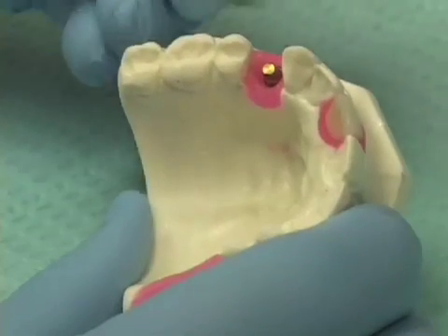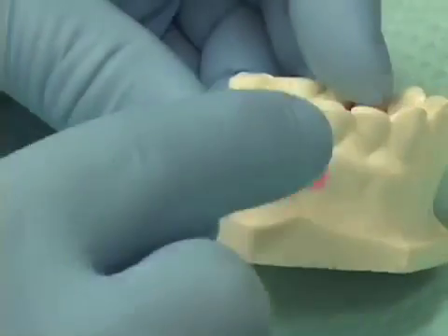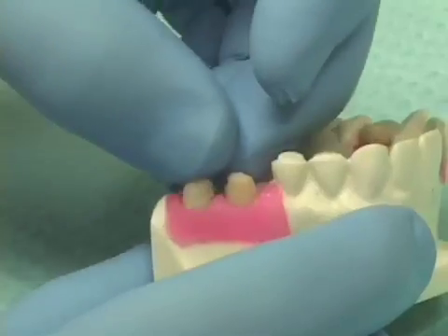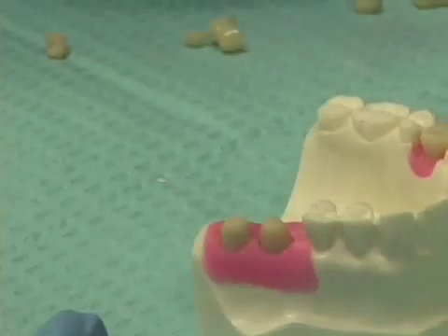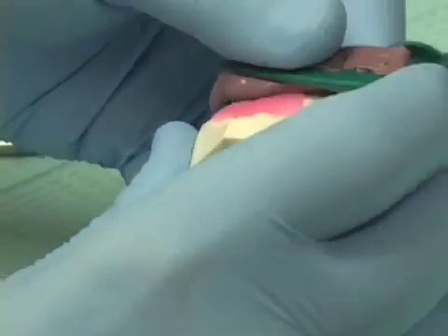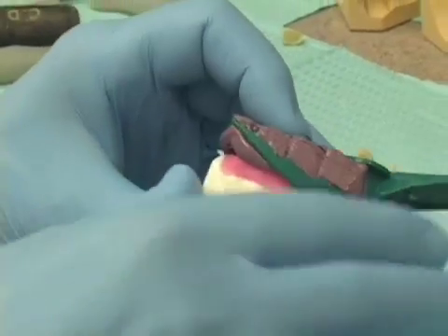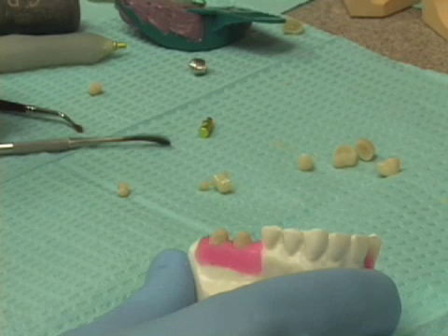That would be the procedure for a single tooth implant. If we go to a multiple tooth implant, which we have on the other side of the arch, what I have done in preparation is made two of these sleeves that will fit down very nicely over the top of my abutments. What I may do is take an OmniVac made ahead of time, or take an impression, seat that right down over those copings I made, and let the acrylic polymerize. That acrylic will bond to the two copings, giving very nice marginal adaptation and a good external contour.